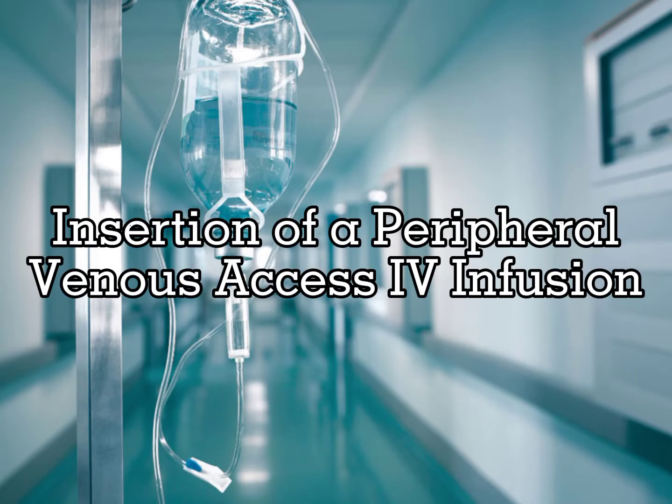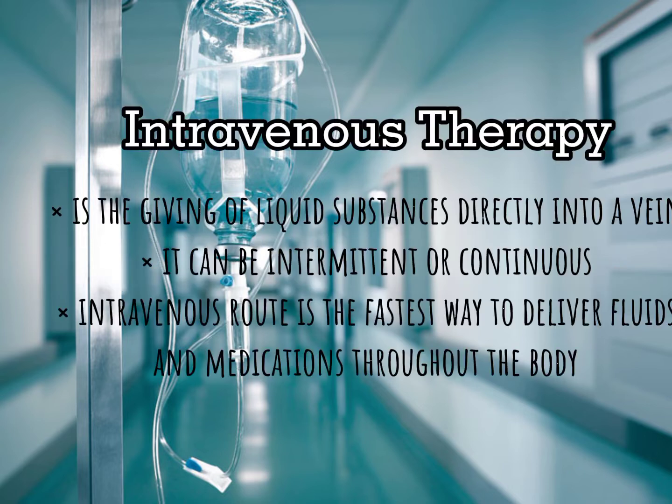Insertion of a peripheral venous access IV infusion. Intravenous therapy, or IV therapy, is the giving of liquid substances directly into a vein. It can be intermittent or continuous. The intravenous route is the fastest way to deliver fluids and medications throughout the body.